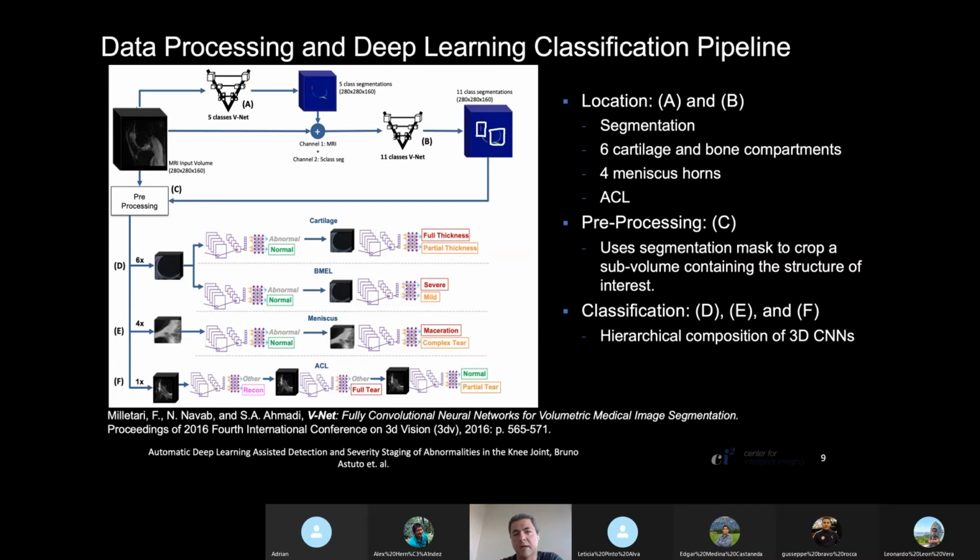But they are using deep learning to fill the gaps of this reconstruction and reduce the noise, and have an image with the same quality as the fully sampled spectrum.